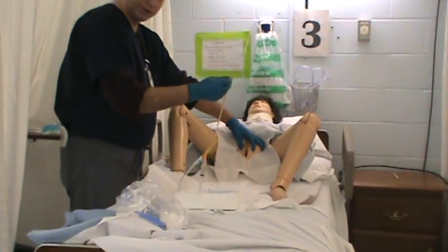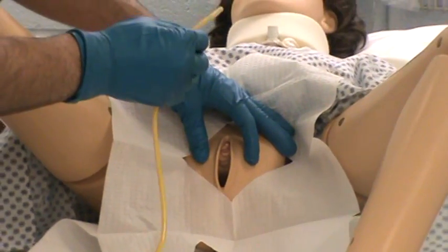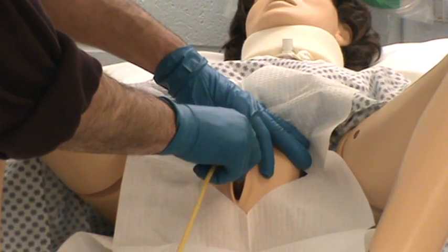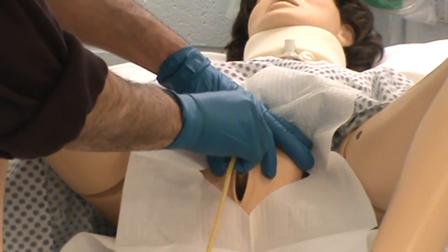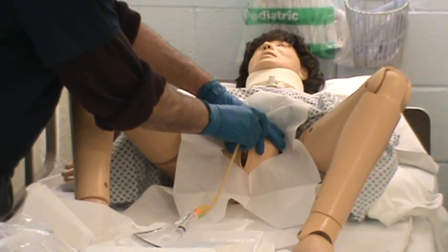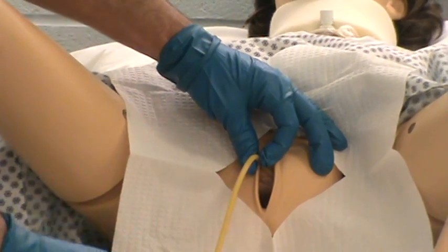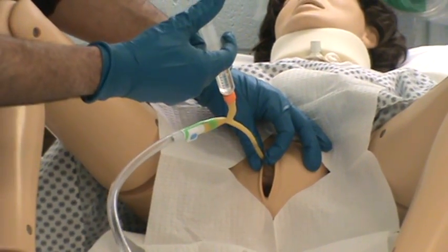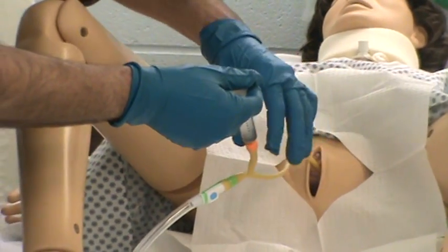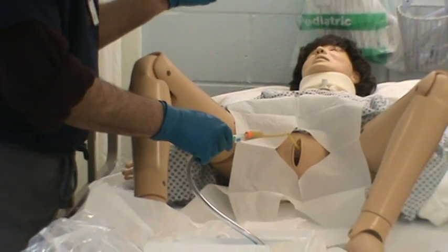We're going to simulate inserting this into the urethra. I'm going to tell the patient they'll feel some pressure — take a deep breath in and blow it out. I'm going to insert, and it should insert nice and easily. We're going to insert it until I see urine. When the urine starts flowing down the tube, I'm going to insert it maybe an inch farther to make sure we're up into the bladder. Then I'll grab it, hold it, and start inflating the balloon. Once the balloon is full, I'm going to disconnect — the patient should not be feeling any discomfort at this time.